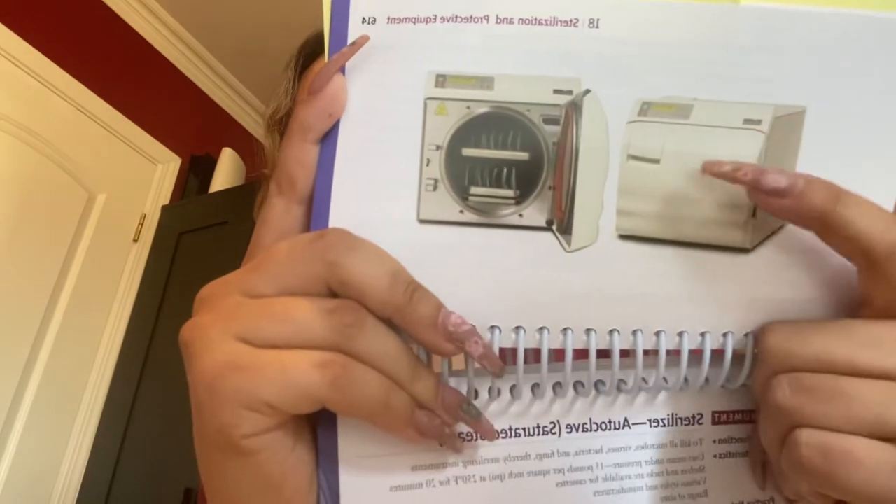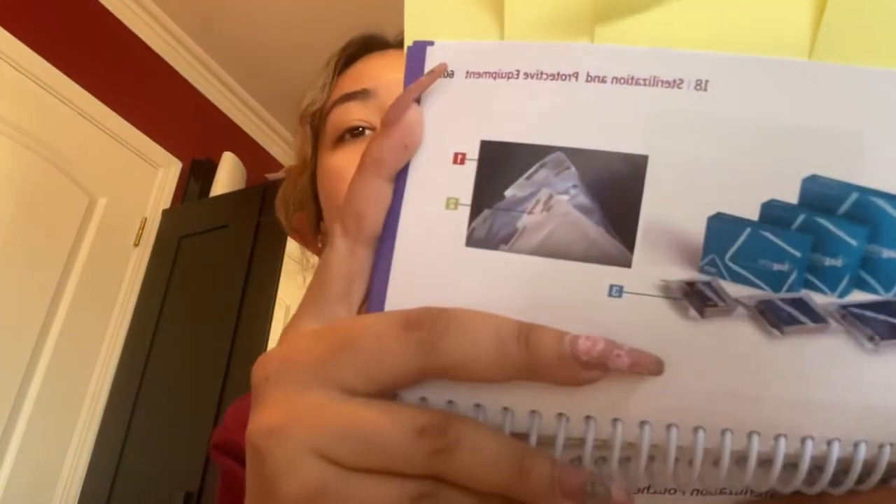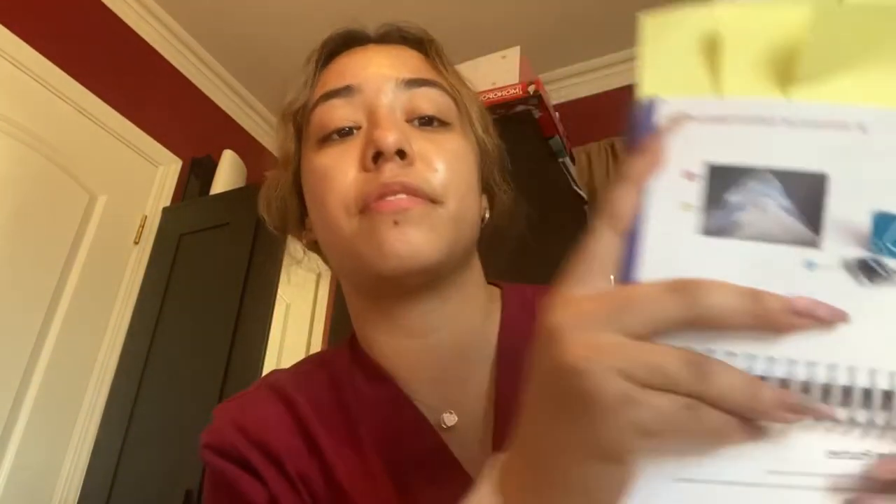It has levels — sometimes two, sometimes four — each autoclave is different. The instruments that are loaded into it are placed into a sterilization pouch. We label these pouches with the operator's name and the date so we know who processed them and can track if they were taken out too early.